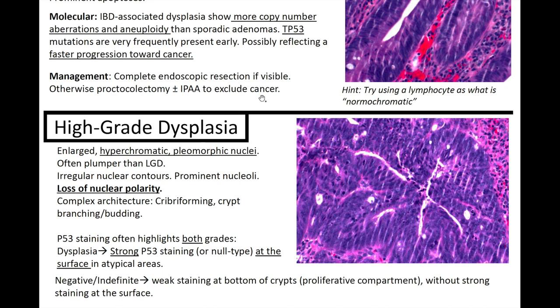In high-grade dysplasia, you'll see enlarged, hyperchromatic, pleomorphic nuclei — often more plump than in low-grade dysplasia — with irregular nuclear contours, prominent nucleoli, and loss of nuclear polarity. You can also have complex architectures such as crypt cribriforming, crypt branching, and budding. Compared to the well-behaved low-grade dysplasia, high-grade dysplasia looks much more disorganized and chaotic on a cellular level — a lot more turnover, replication, and cells acting aberrantly, representing a more worrisome process moving toward adenocarcinoma.